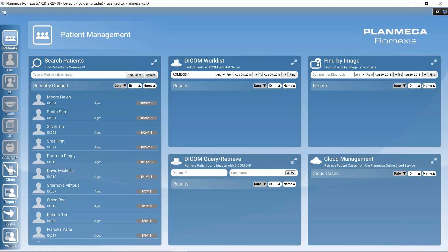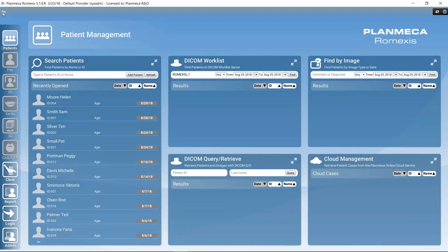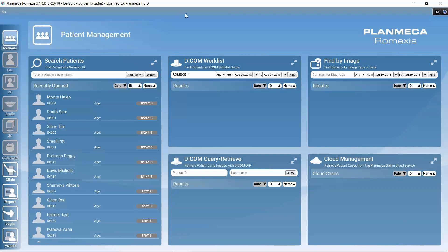There are two options to close Romexis: open the file menu and select Exit, or simply click the X in the corner. Both work equally well.